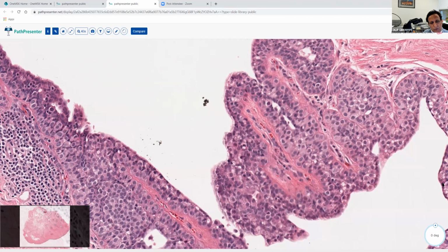But every now and then, the very low-grade DCIS may also colonize the ductal walls, and it may create some confusion. And that is where you can use E-cadherin stain. The resolution power of E-cadherin stain is very good, actually. I have seen examples where a single duct may be involved both by DCIS and LCIS, and the E-cadherin stain will elucidate that for you.